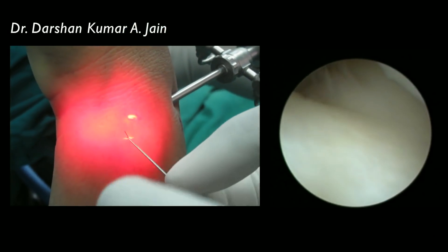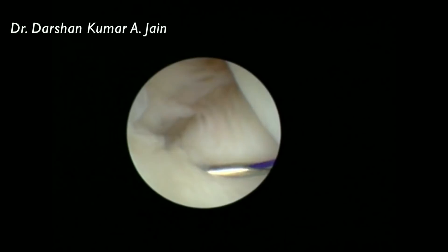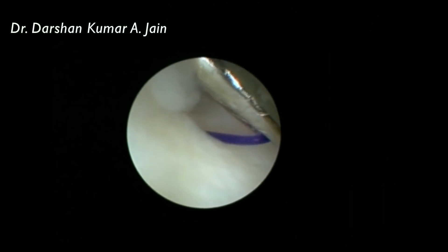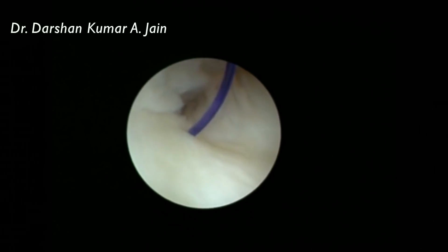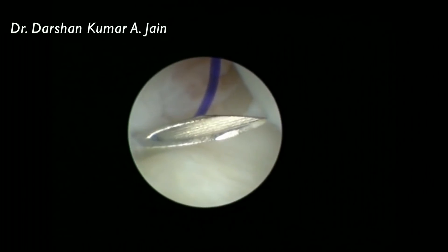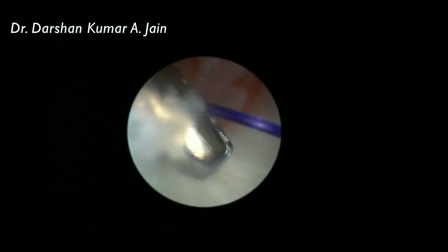We pass a needle just proximal to the 6R portal, and a PDS 3-0 is passed — an Ethibond can also be used. Once this is passed into the radiocarpal joint, the PDS is grasped through the 6R portal using a grasper and delivered outside. Similarly, another suture is passed depending on the width of the tear. There are various modifications of this suturing technique; one of them is the Mason-Allen. These are the simple sutures used here. This is the second stitch, brought out again to the 6R portal, then delivered subcutaneously to the portal where the needle was inserted.